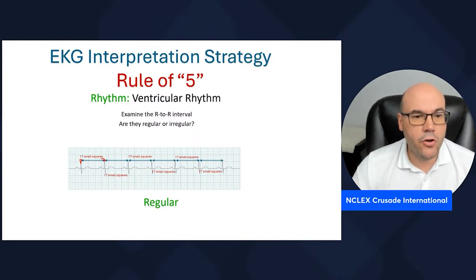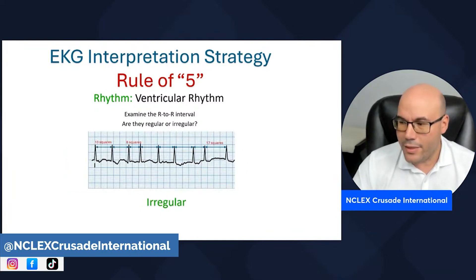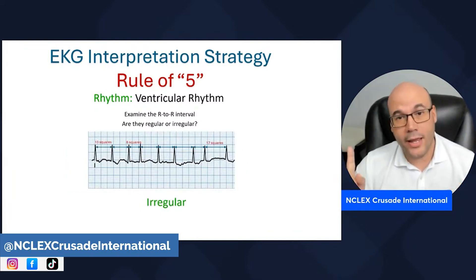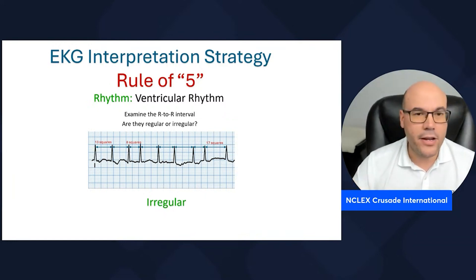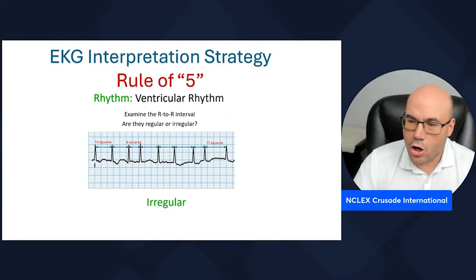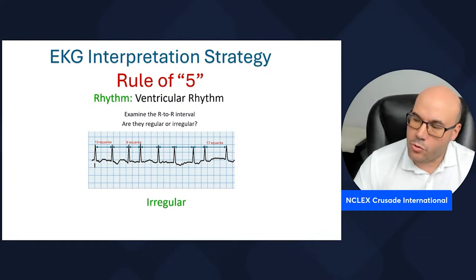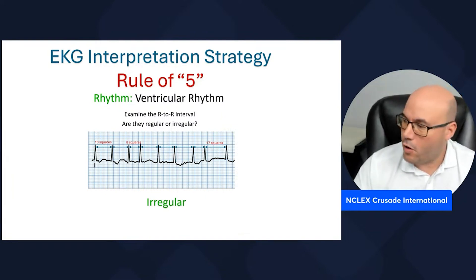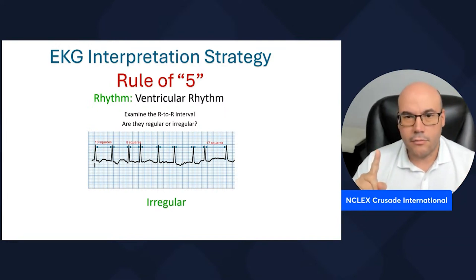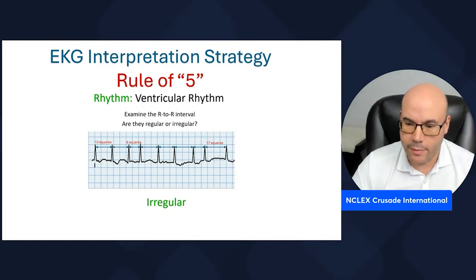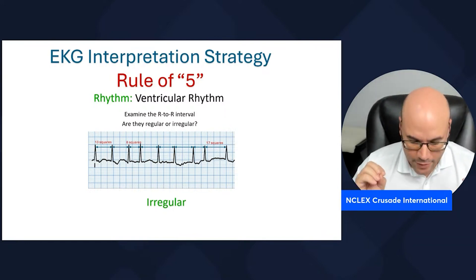Now here's an example of an irregular rhythm. When you count the small squares in the R to R intervals, you'll see they vary. For example, the first R to R interval has 13 squares, the third has 8 squares, and the last has 17 squares. Since the counts differ, unlike the first strip, this rhythm is irregular. That's how you identify if a rhythm is regular or irregular.